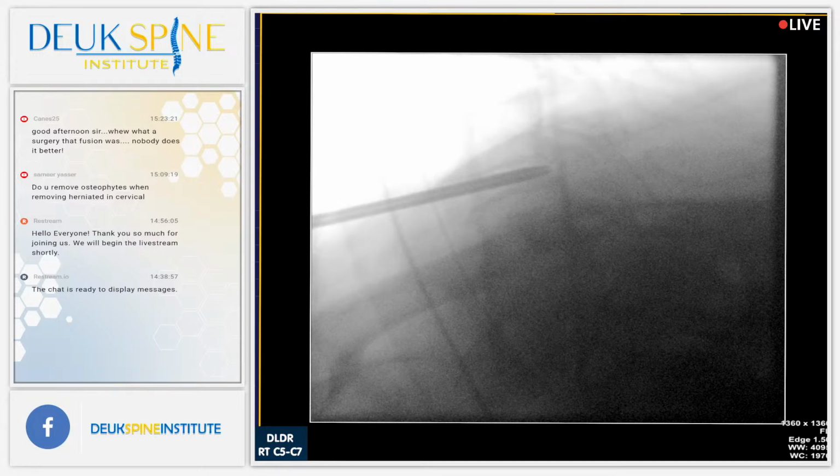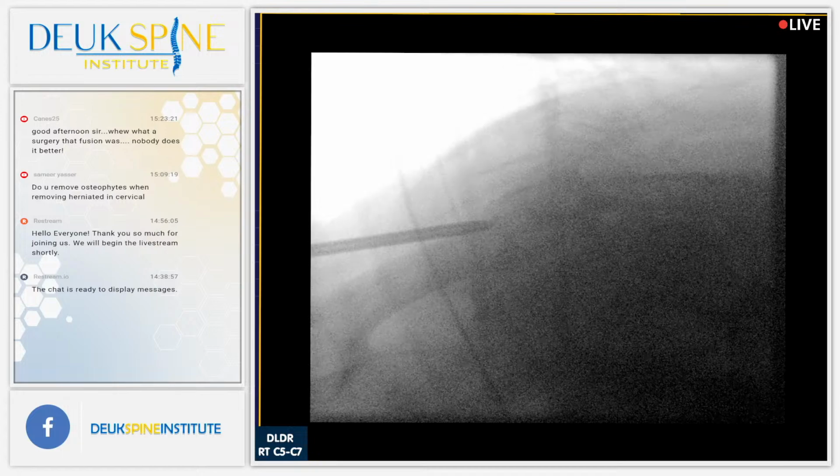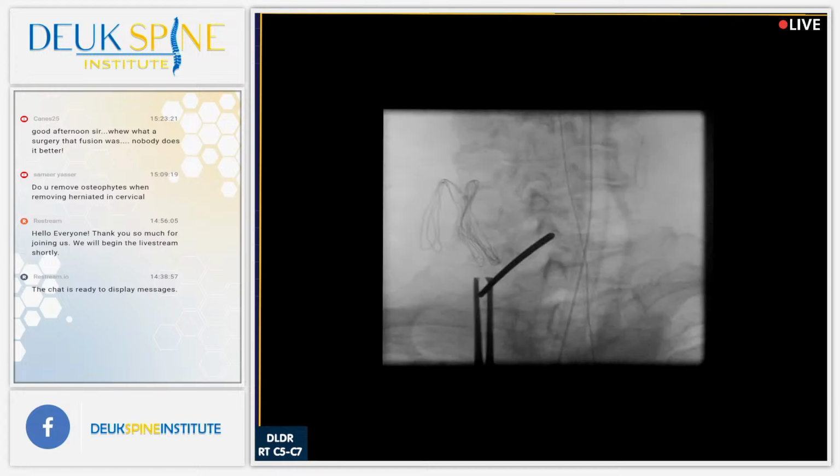All right. We're going to move south. The question is, will I be able to do this with his clavicle in the way? Shot. I'm coming up. Almost out. I will want to get an AP at some point. And we are out. All right, so let's get a quick AP. APs aren't bad, they're easy to get because the shoulders aren't in the way. And then I've got just a few millimeters to go and we'll be in the next disc.